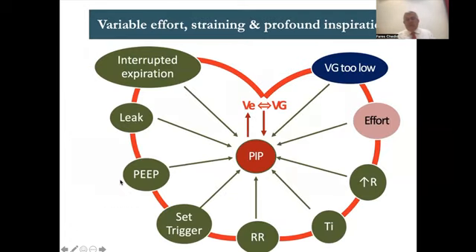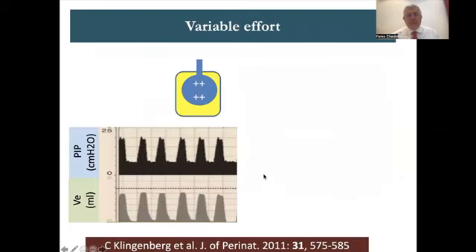So now we spoke about everything. We still have 2 points to present. How do the efforts of the patient affect the PIP? Here is a patient, you see from this graph, this patient is doing no negative pleural pressure at all. He's totally sleepy, not active, probably sedated, whatever it is. The patient is doing no activity at all. The machine is doing the whole effort, and the volume is stable all the time. That is good.